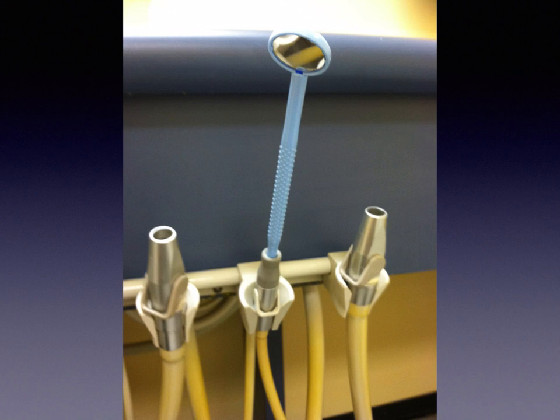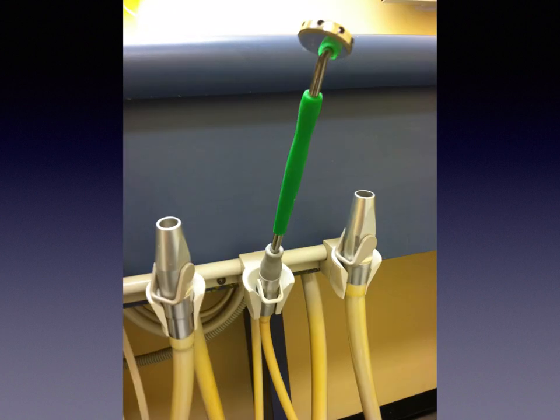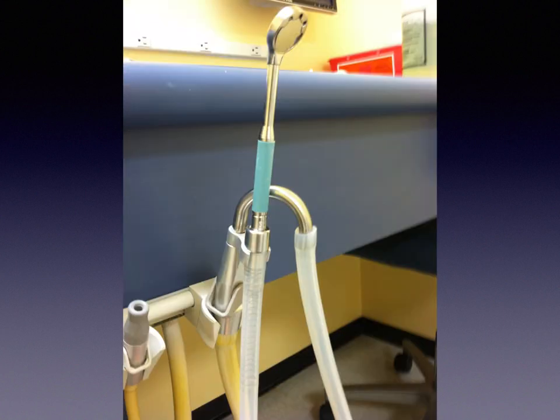Here I have the Mirror Vac attached to the saliva ejector valve, and also the Diodent in the same configuration. The New Bird is shown attached to the saliva ejector too, but you're going to get weaker suction that way. It's also shown attached to the optional HVE adapter hose, which is $89. I highly recommend getting that if you're going to get the New Bird suction mirror.